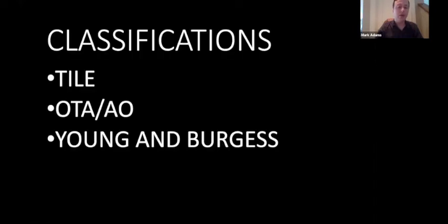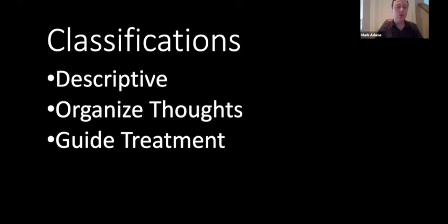Now, there are three classifications in dealing with the pelvis: the Tile, AO/OTA, and the Young and Burgess. These classifications approach the injury from different perspectives. By combining what we learn from each of them, we can engage a patient's injury radiograph thoughtfully and more completely. They will help us describe the injury, organize our thoughts, and guide treatment.